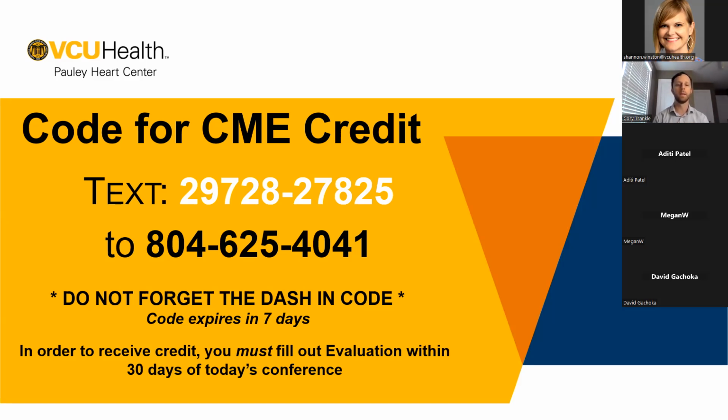So what that ends up being is someone, ideally the treating provider, should think through how badly I need this information from the test that I'm ordering, in our case CMR, and is there any other way we can get this information? So for instance, I think CMR-based stress test is probably the superior stress test, but there are other ways of doing ischemic evaluations. And so if someone's particularly concerned about NSF, then they might not need to.